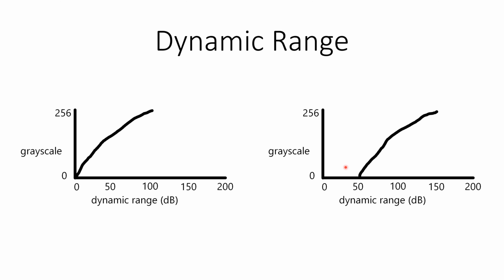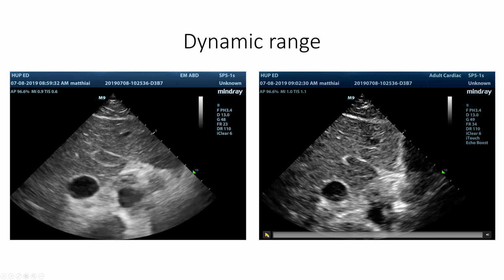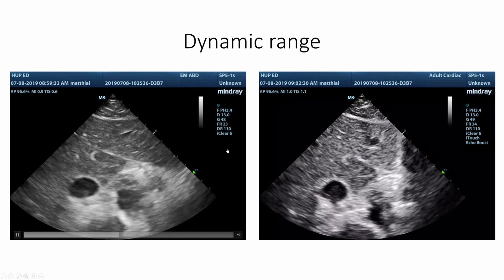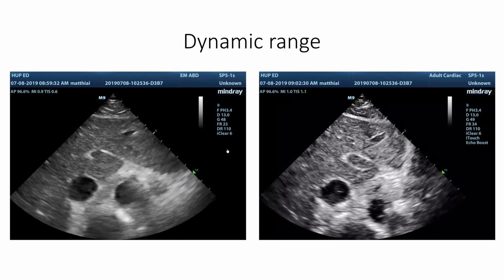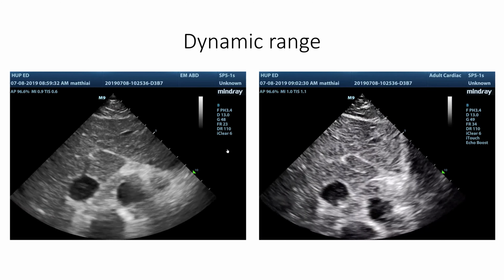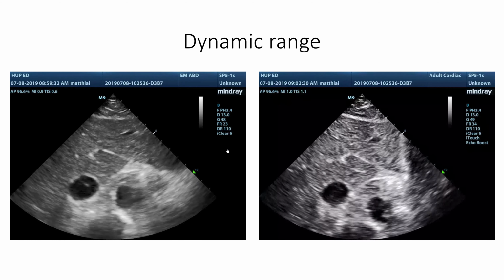And this gets a lot more complicated in how the engineers program these things. But this is, I would say, right up there with images that have too much depth for things that drive me the craziest, and things that new learners or even fairly experienced bedside sonographers mess up and don't understand why their image looks bad.